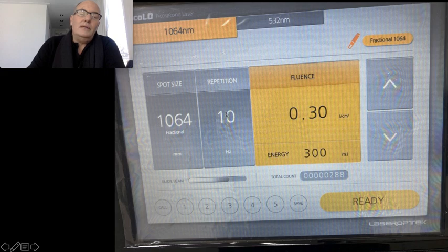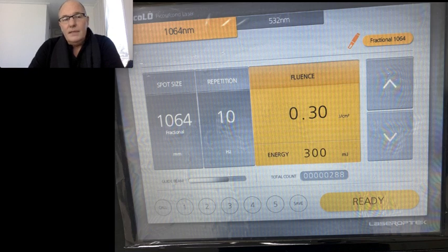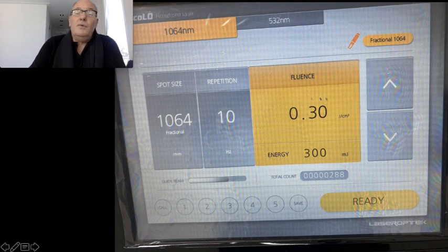I use these hertz because I have used laser for 25 years, but for beginners I recommend using 2-3 hertz, which takes time to move softly, because it's the eyes there, but I use very high hertz. And this is the fluence.